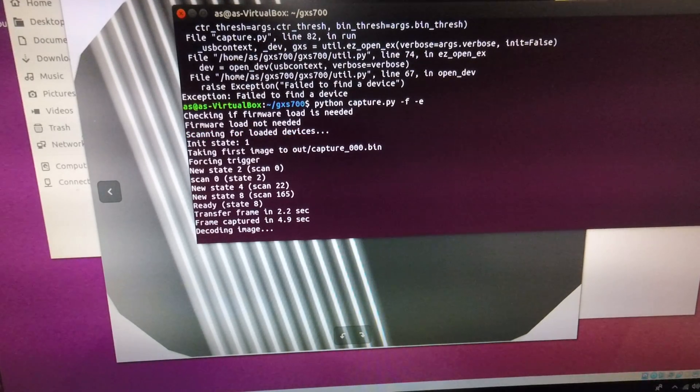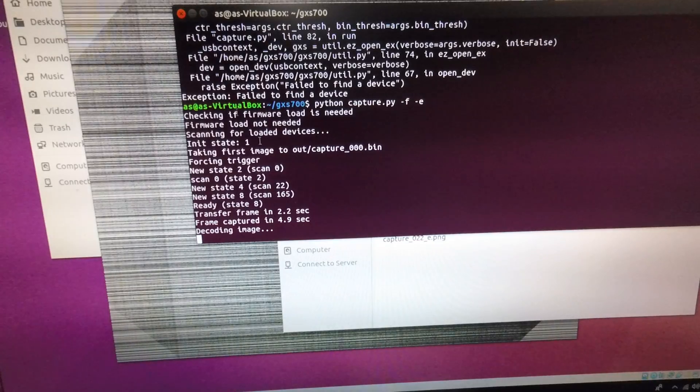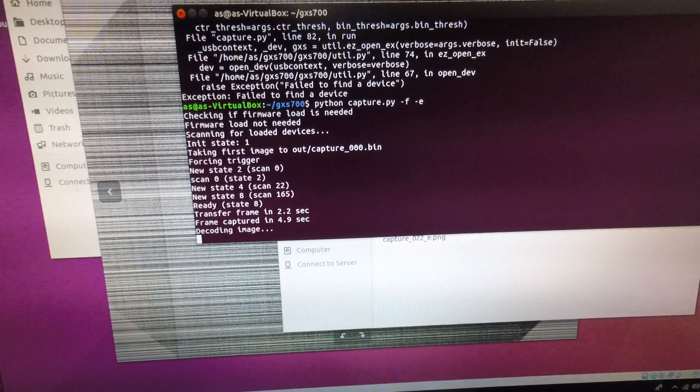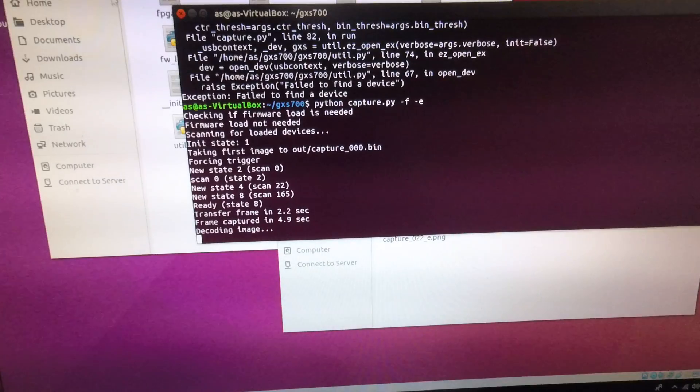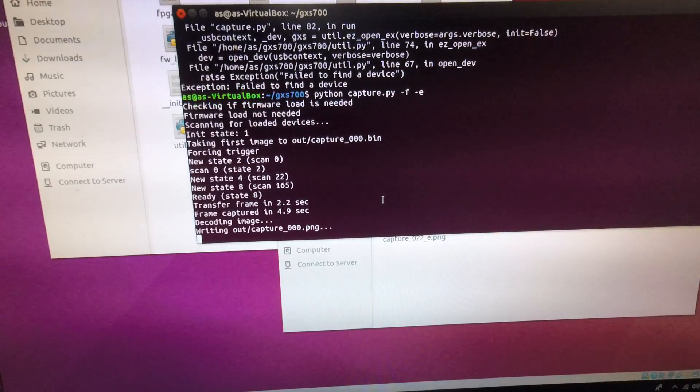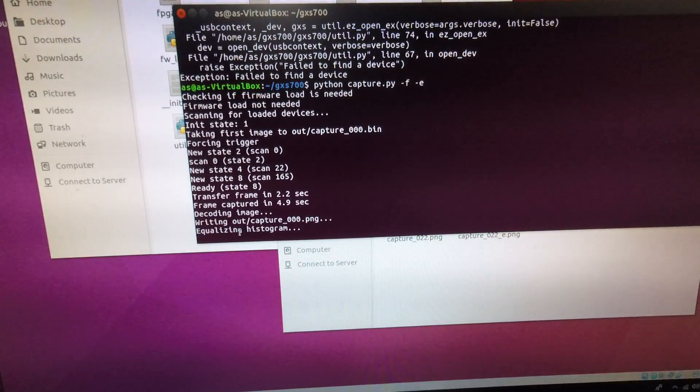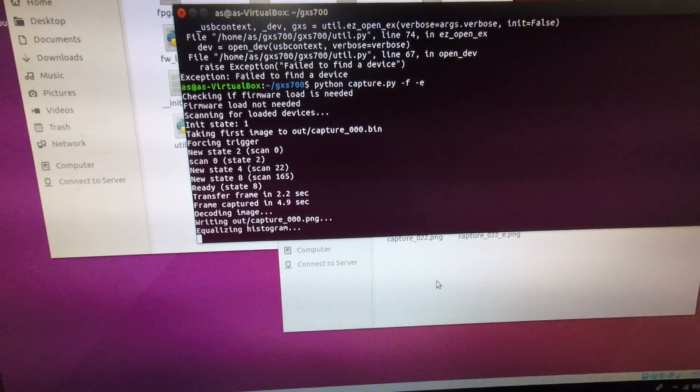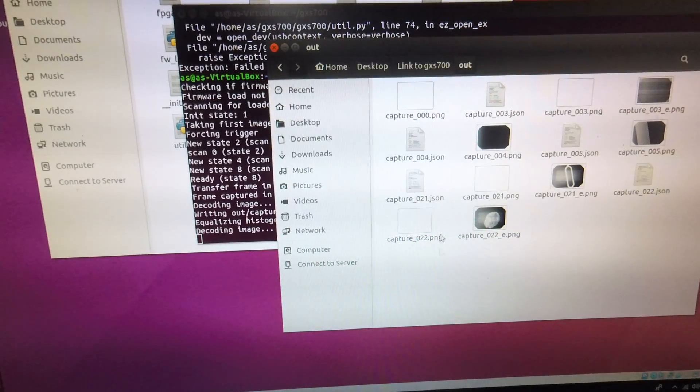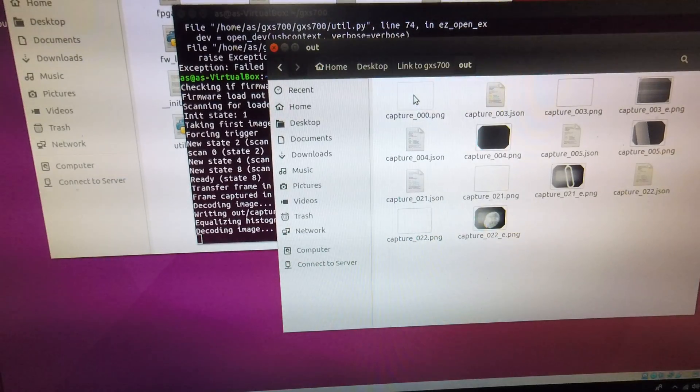It's decoding it. And it's writing the image out to capture 0 0 0 dash png.